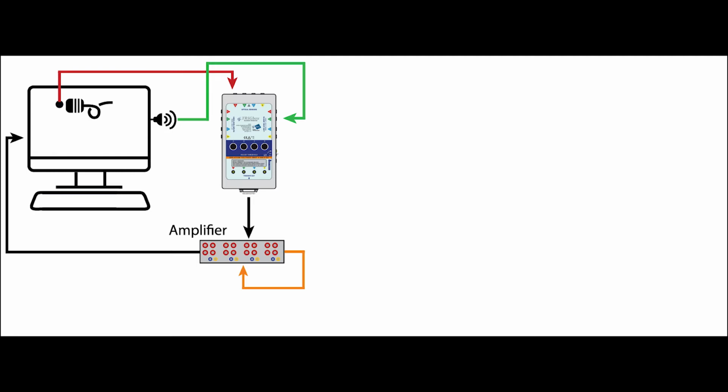This might be necessary if you need extremely precise latency measurements, or you suspect your amplifier has a larger data acquisition latency due to the data transfer method, such as a Bluetooth connection. For example, the GUSB amp latency is on the order of 2 milliseconds. Measuring the amplifier latency involves passing the digital output of the amplifier back into an analog input and requires a custom cable. This is described in more detail later in this video and on the BCI2000 certification tool wiki page.